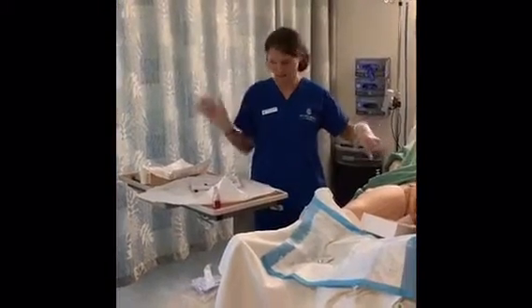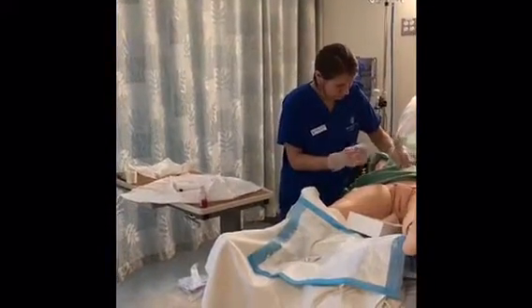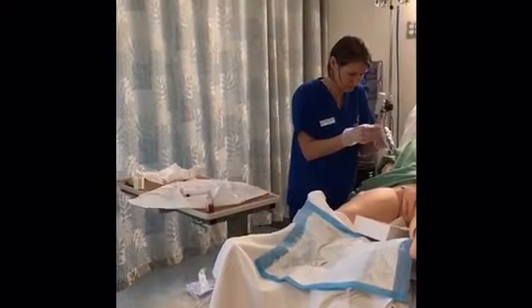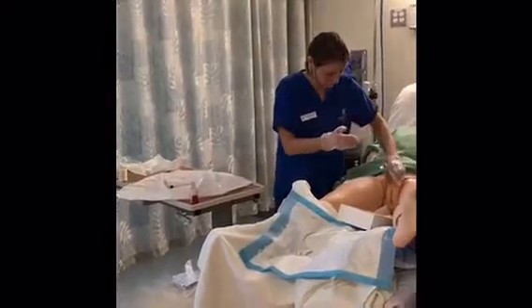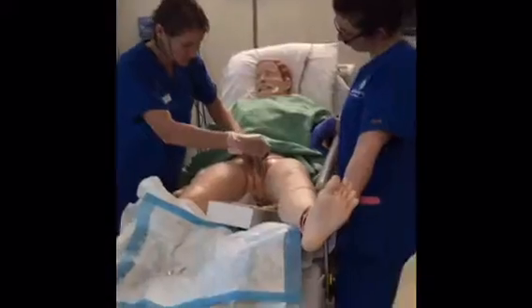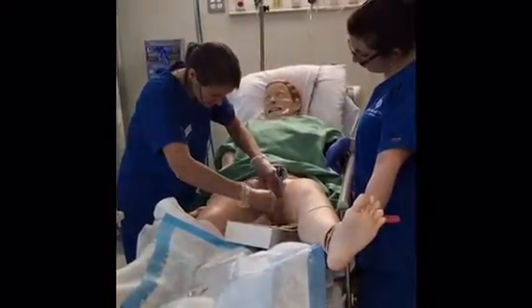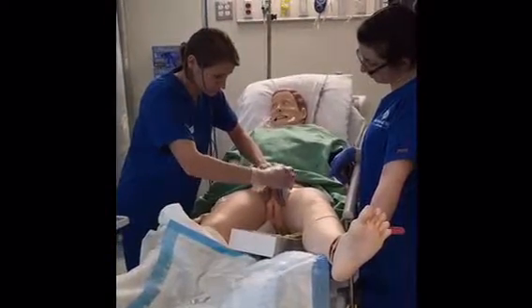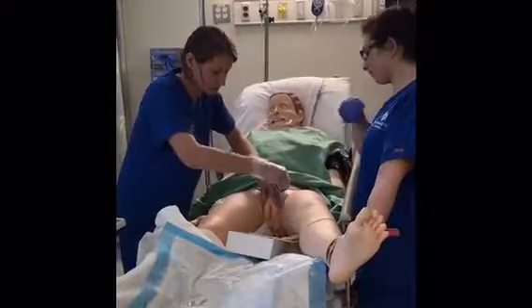So now I'm going to use my left hand. It's going to be my clean hand, and I'm going to open up the labia so I can clean the meatus. And prior to all of this, I would do pericare if needed. So I would do each labia and then the meatus from front to back.